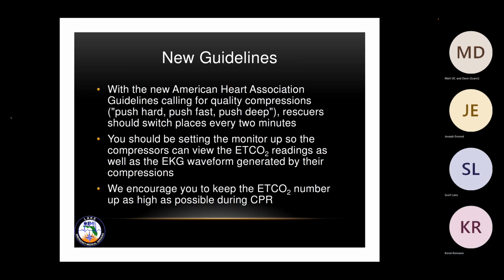By 6. All right, so new guidelines from the American Heart Association for quality compressions: push hard, push fast, push deep. Rescuers will switch places every 2 minutes, right? And it's still being pushed today. Now, this presentation was made in 2012, but even in 2021, it's still being pushed in that direction. So we encourage you to keep an eye on end tidal numbers as high as possible during CPR. That's our goal behind it.